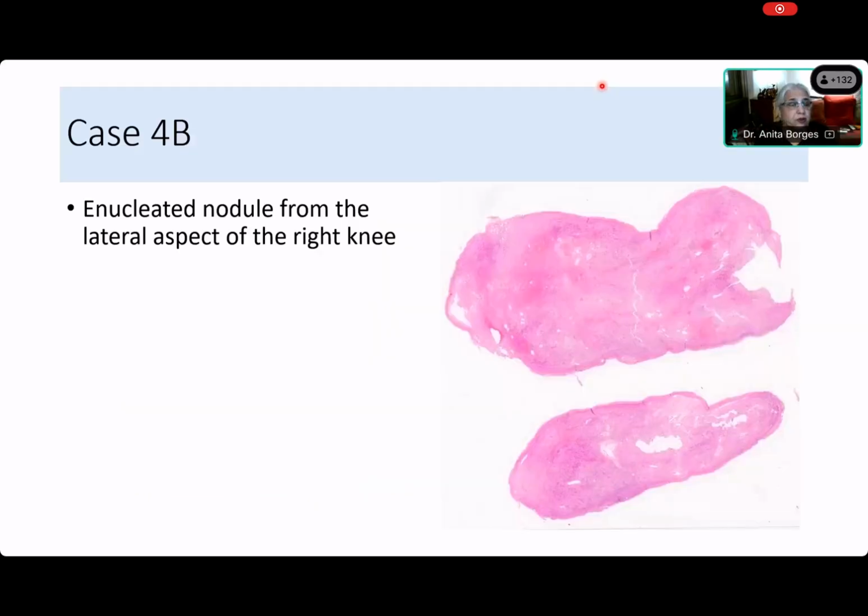Okay, here we are now. Who's going to do 4B? We have to go up again. Is Saida there? Saida, are you there? Ma'am. Saida? Yes, ma'am. Very good. Come on, Saida. You're doing 4B. Come on, read it.